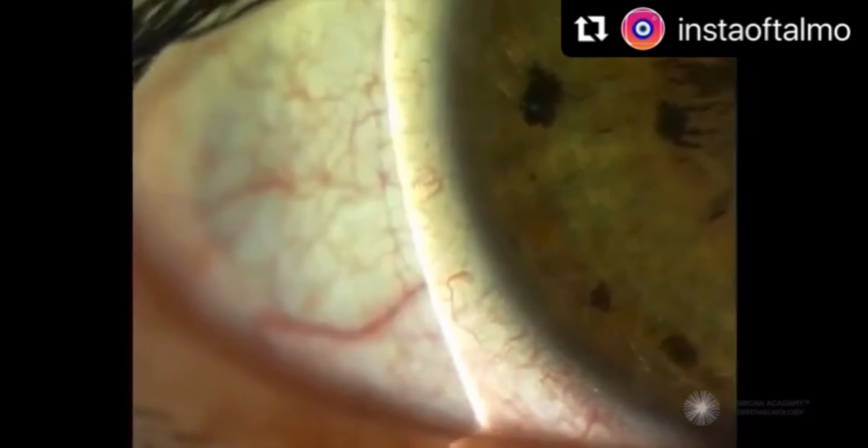See the anterior and posterior portions of the cornea, and then a clear interval space before one sees the iris. We then use the thickness of the cornea, as seen here, as a ruler and compare that thickness to the thickness of the anterior chamber. In this young myopic patient, you can see that the chamber is much deeper than the thickness of the cornea.